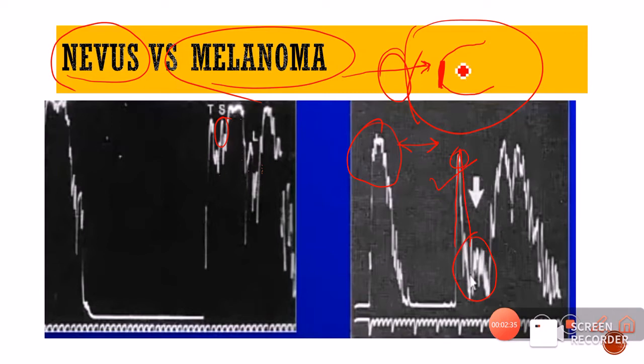However, as the sound enters inside the melanoma, the structure now is not going to change much, and therefore it's all dense. It is a very dense structure and a lot of the sound energy is going to get absorbed. Therefore, we are going to see this attenuation. That is, the spikes are now going to reduce.